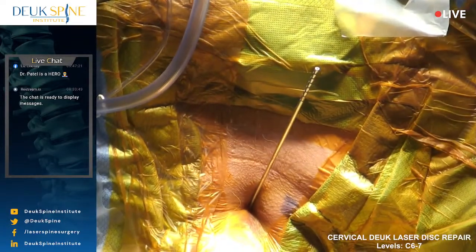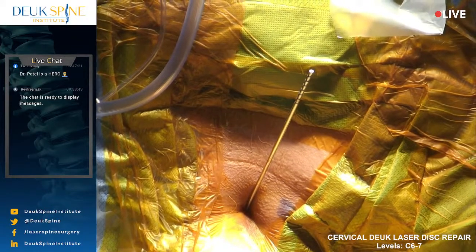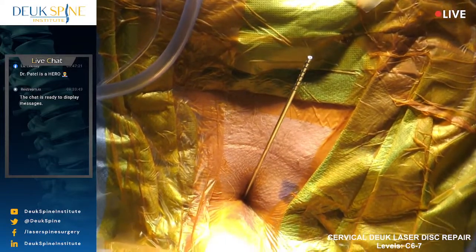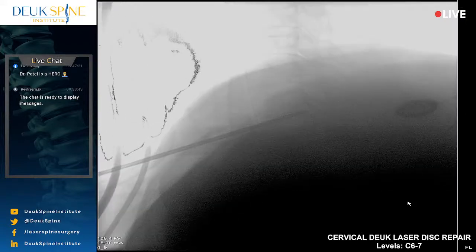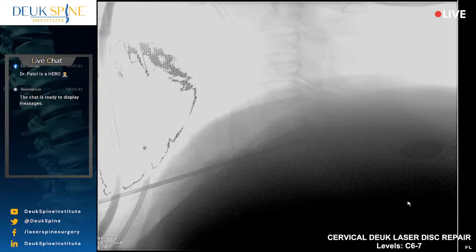Let's just verify that. I want to make sure it's C6-7. No, lateral. A zoomed out lateral. Not terribly zoomed out. I still need to see this disc, or at least the C6 bone. I need to see C2. You need to show me C2. So the dilator looks perfect. Further north, a little less exposure. So 2, 3, 4, 5, 6, 7. All right, that's good.